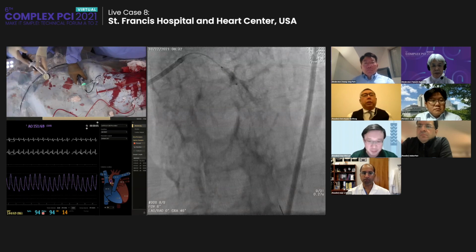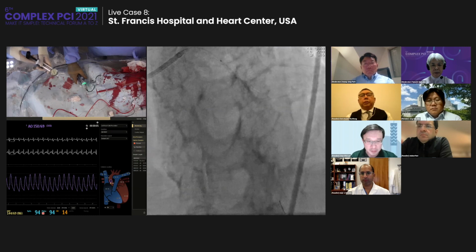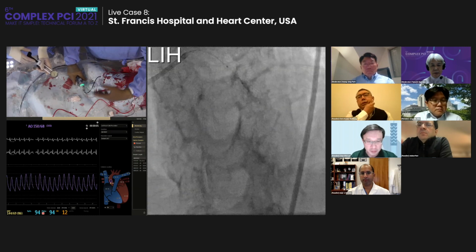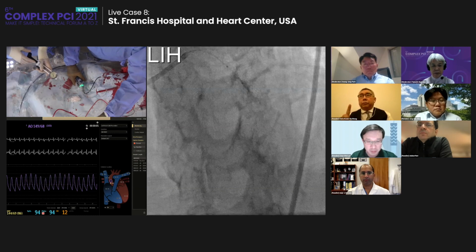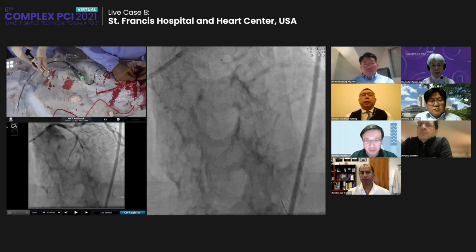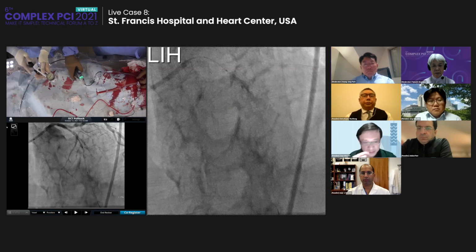So I set my balloon up based on my OCT with co-registration, and we magnify it, and I could line the dots up exactly. I delivered 10 pulses. The Shockwave device lets you deliver 10 pulses, and then it rests, and then it lets you activate again. So we gave 10, he asked me to pull back a little. So as Rich said, just to think about the geometry of the electrodes is important.